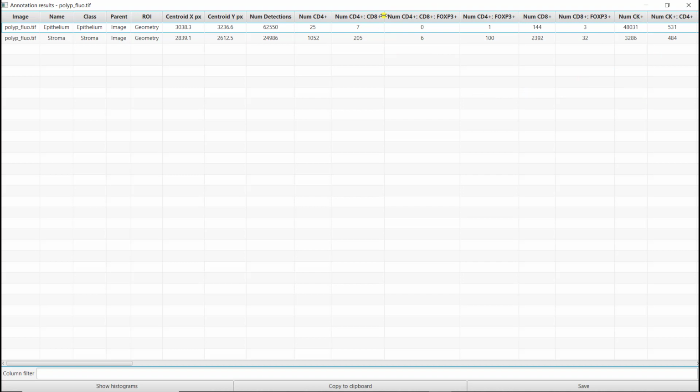Here, as we identify each marker independently, it's very much possible that we end up with combinations that we are not expecting. And so maybe we can do some post-processing if we assume that some combinations are not possible and that, for example, we have a cytoplasmic marker that is more likely to spread out and maybe consider a cell positive for this cytoplasmic marker where it's not.